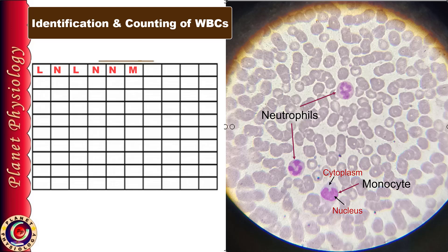Now I am moving the slide without announcing the names of the WBCs. You can pause the video and try to identify each cell as you get the next WBC.